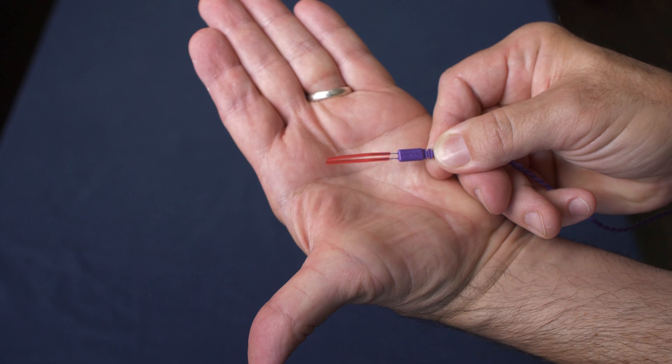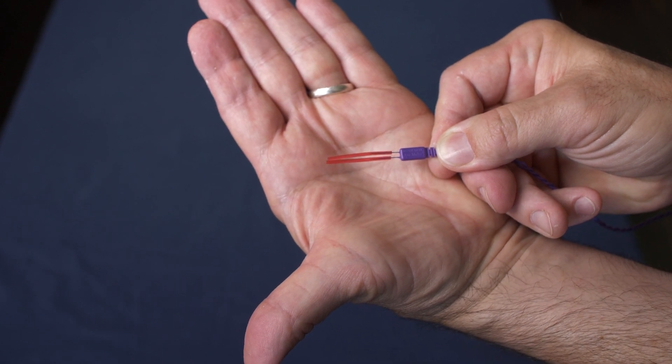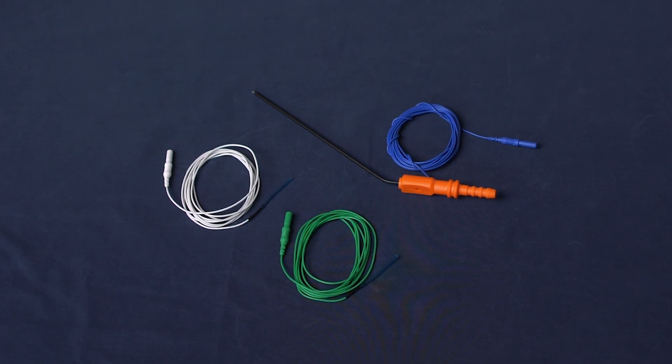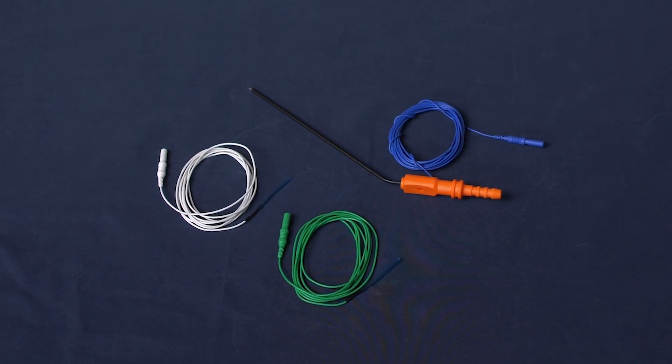They are sheathed in the kit, so please leave that on until handed off. Mastodon kits also include a green and a white needle. The white needle is for your stimulator return, and the green will be used for your EMG grounding.